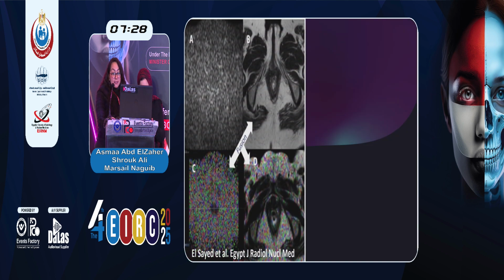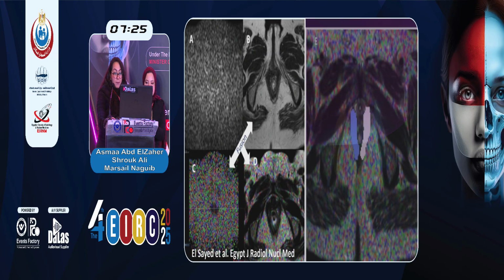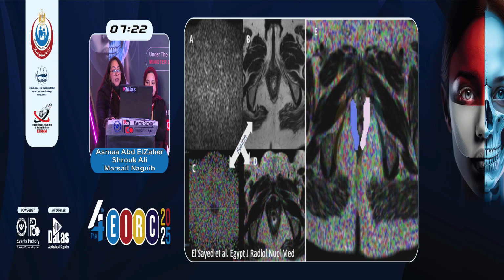Let's apply this to processing of DTI. Image A, 2D of fractional anisotropy map, 2D gray. B is an axial anatomy T2. C is the color coded of fractional anisotropy. And D is the combined and fused anatomy with the color coded fractional anisotropy. E is a representation of one of the muscles that we have traced in our study with the ROI applied on the right and left puborectalis slings.